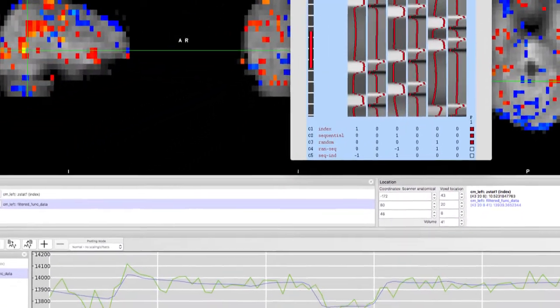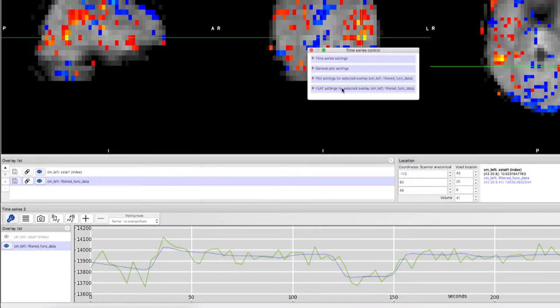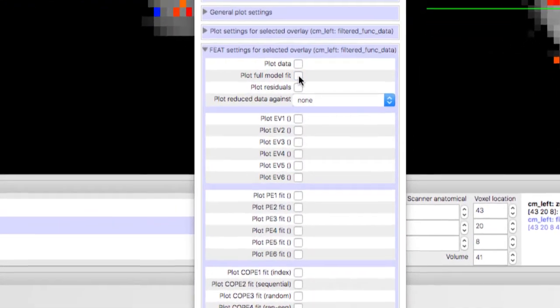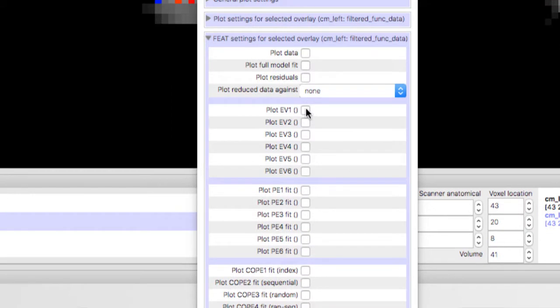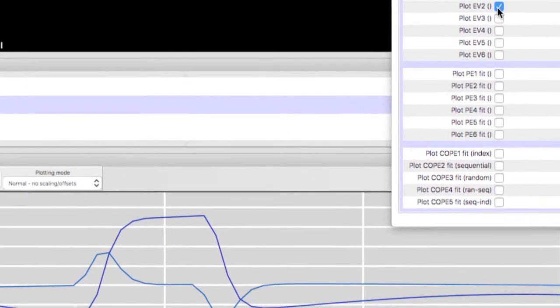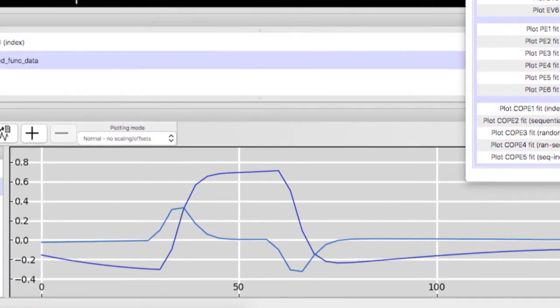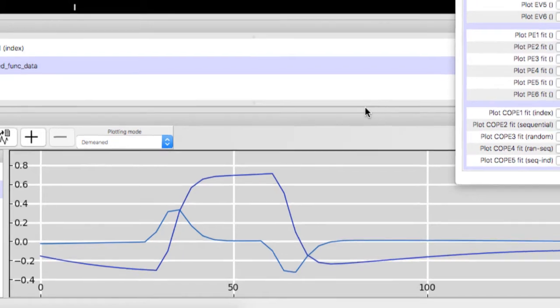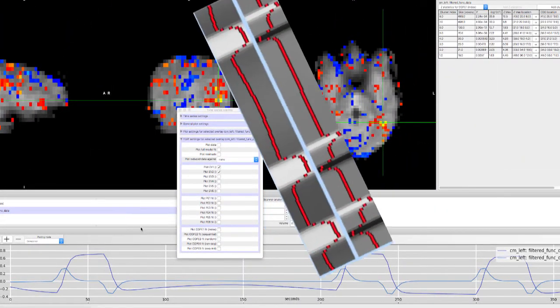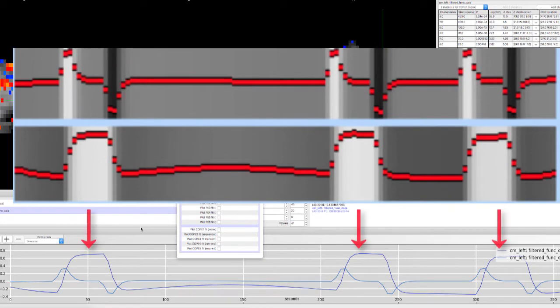Highlight the filtered func data, then click on the Spanner button and Feat Settings for Selected Overlay. Uncheck Plot Data, and uncheck Plot Full Model Fit. Add the first two EVs, which are the regressors, and in plotting mode, select Demeaned. This shows the HRF and its time derivative before they have been scaled to fit the data. Note how the design matrix and the time series display the same information for this regressor.